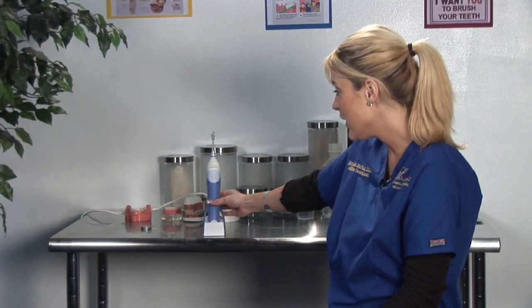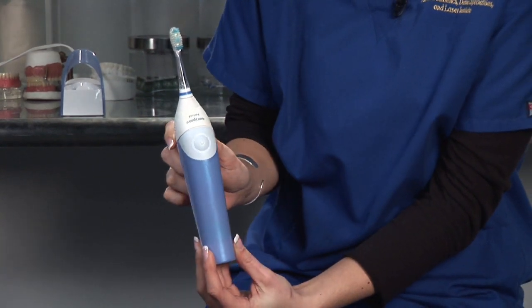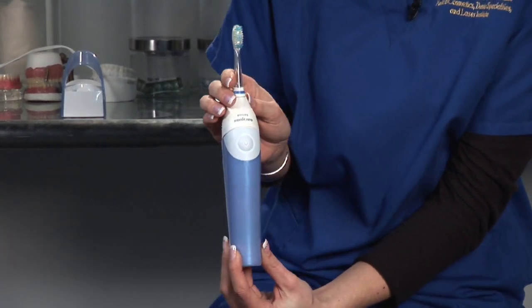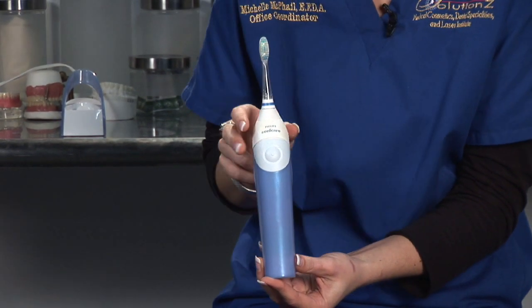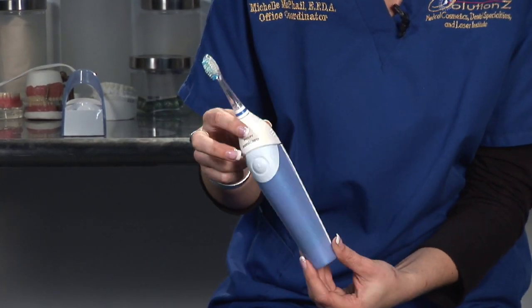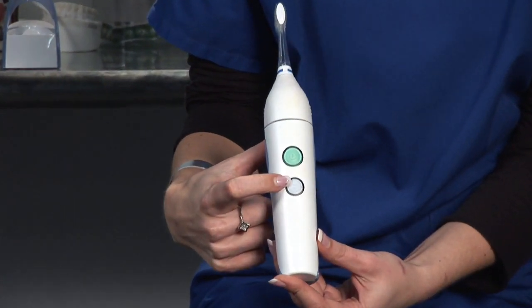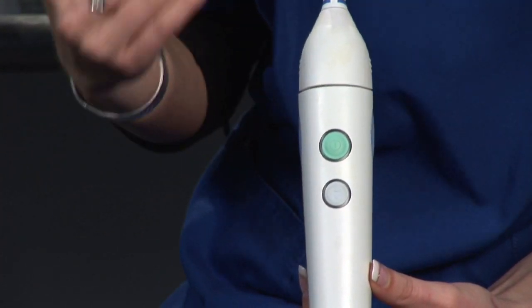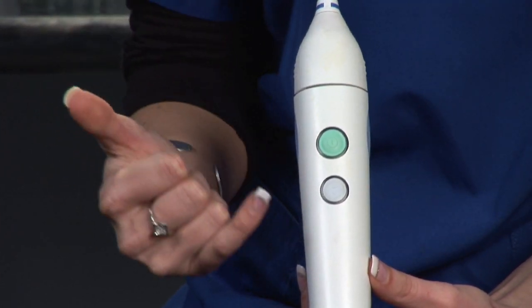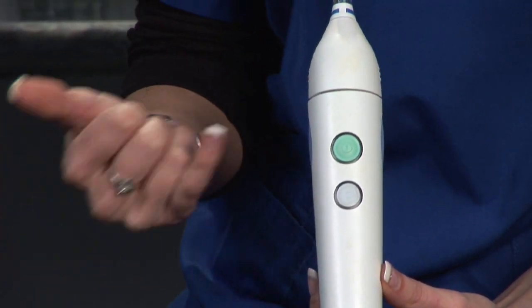Let's take a look at the toothbrush we have here. This Sonicare toothbrush is great because you do not need batteries — it comes with a charger. If you look on the back, it has the on button and another button that's a timer. You can set a timer for three minutes or even five minutes. It has different settings.